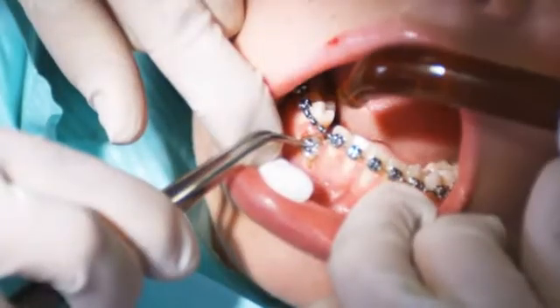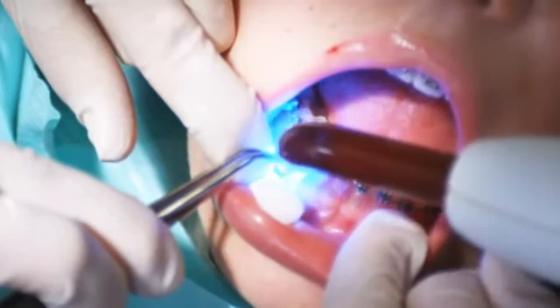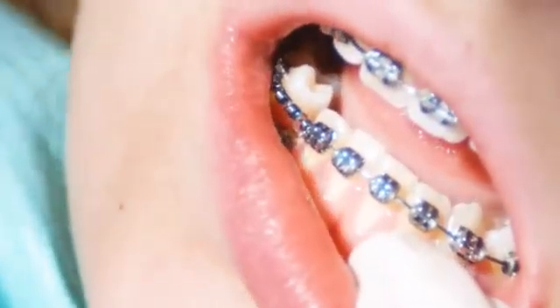The advantage of laser treatment in this case is that the soft tissue can be removed quickly and, most importantly, with no bleeding, so that the bracket can be affixed without any problems.